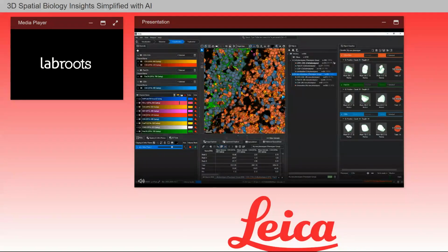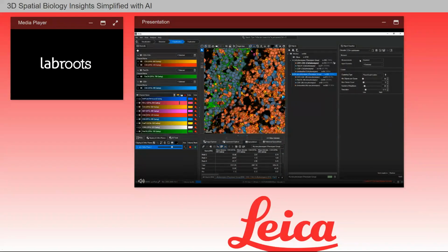Let's go back to the object classifier. I will now select the CD4 subcluster classifier from the drop-down menu. This is my predefined automatic classifier using the PhenoGraph method. When I click on the measurement dropdown, I have the option of using standard or mean intensity measurements, or custom, which allows you to select intensity or morphology measurements. I have 4 channels selected: PD-L1, CD4, Ki-67, and FOXP3. Next, I am going to select my CD3, CD4 positive phenotype as my object set to apply this classifier on. Let's give it a few seconds to run.